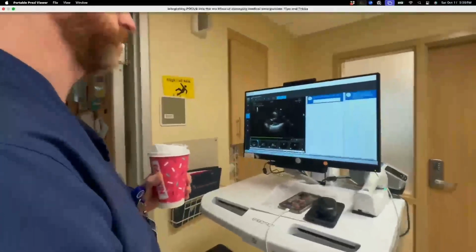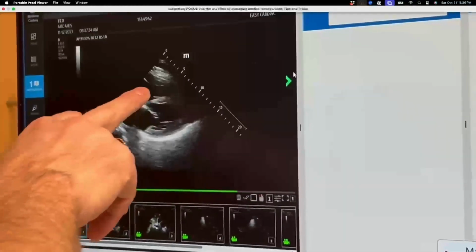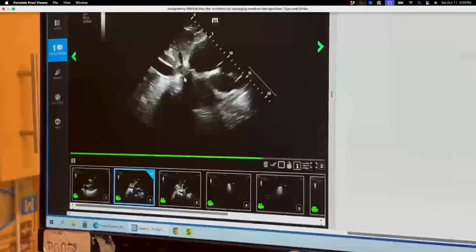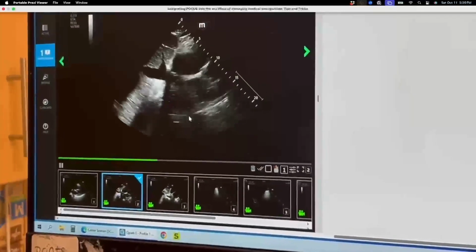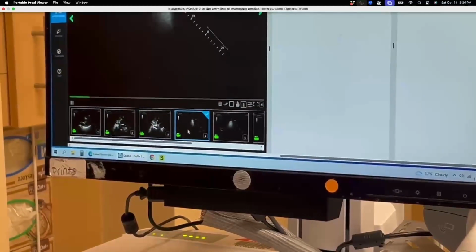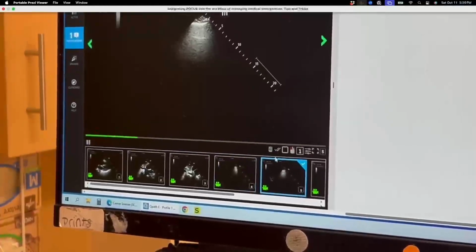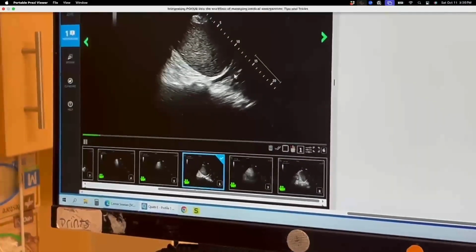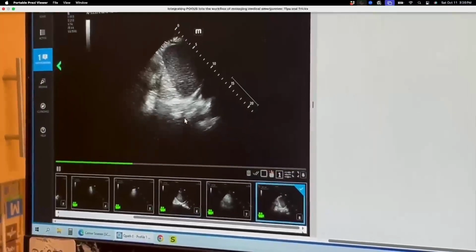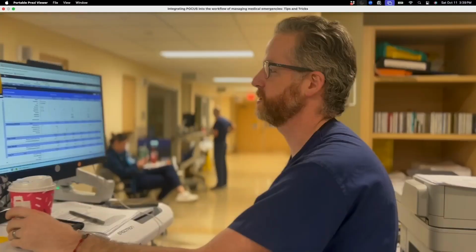Bedside POCUS pre-rounds. There's no pericardial effusion. Right ventricle. Now the images are saved in QPath, so during rounds we can actually look at the entire examination. The IVC looks like it's full. Grab the view of the aorta just to verify that I wasn't looking at the aorta before. This right apical chest shows A lines, and the left chest, A lines are present. You can see a small amount of atelectasis in the lung. There are no dynamic air bronchograms. This is going to be the left lung here. Complete physical examination, diaphragm, basically without entering the room.